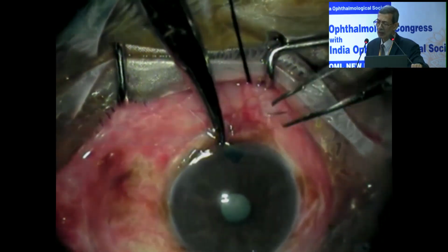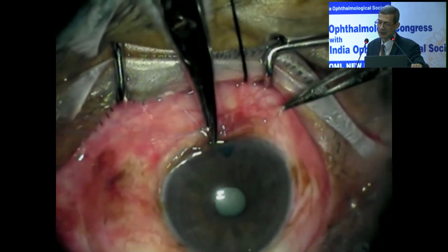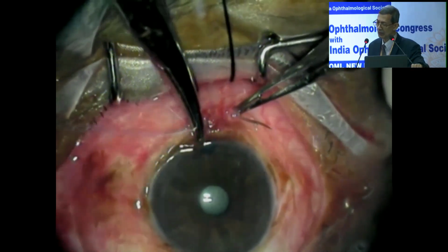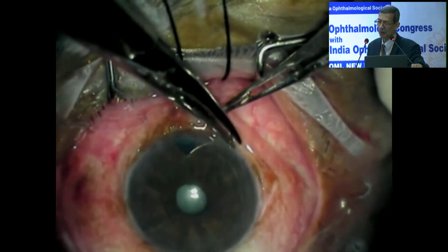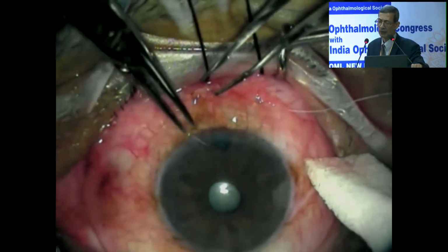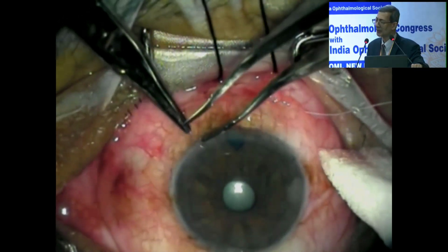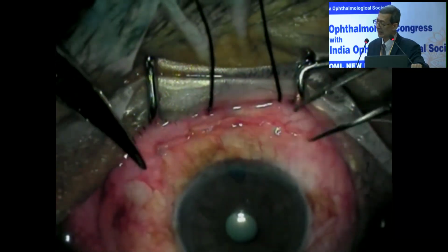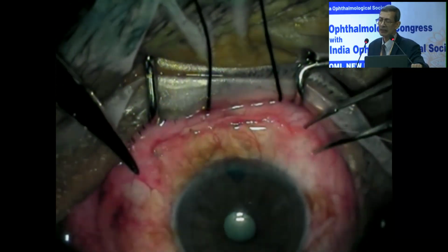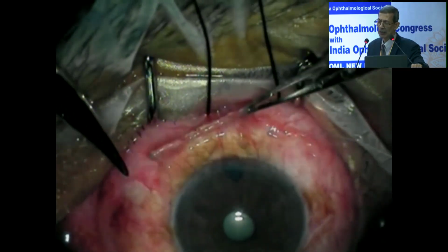I do not use mitomycin, as I told you, in most of the surgery. Even now, the surgery which you are seeing here was performed in the year 2001. This is more than 24 years ago surgery. I still do this surgery in the same way. This is the surgery I saw my professor N.N. Sood used to do, and I learned from him.